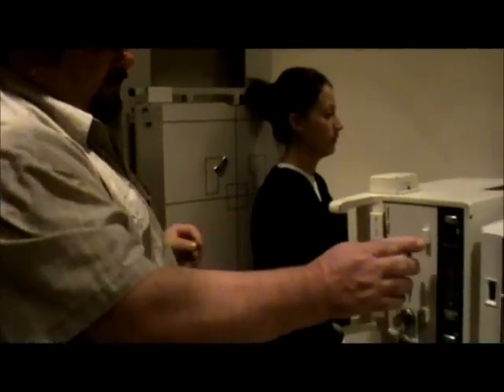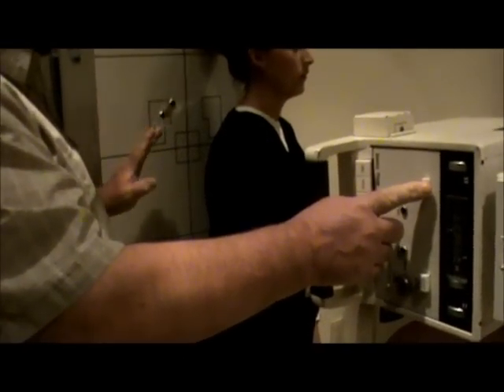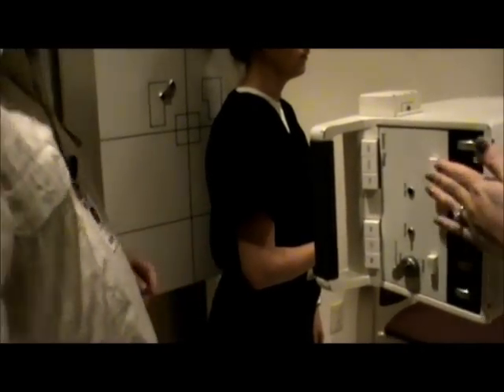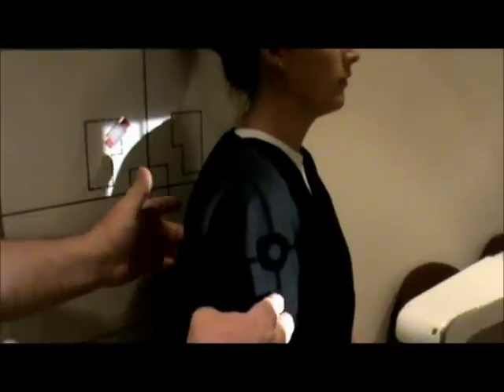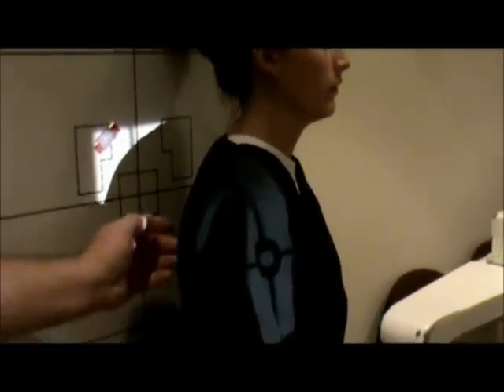I want to show you a couple of different ways technologists position for this view. One is that some technologists place their fingers on the body of the scapula from the back and on the front of the shoulder, and line it up so that when the fingers line up, they know the scapula is perpendicular to the board. Another way I personally use is to palpate the medial border of the scapula and rotate until my finger is perpendicular to the IR, then put my other hand on the front of the shoulder — the center of the humerus — and match them up. When those two are straight up and down from each other, I know the body of the scapula is perpendicular.